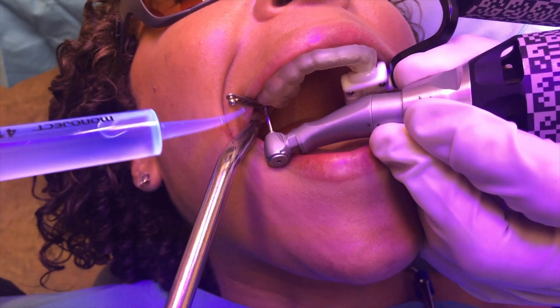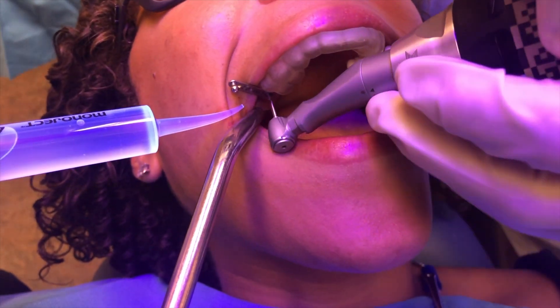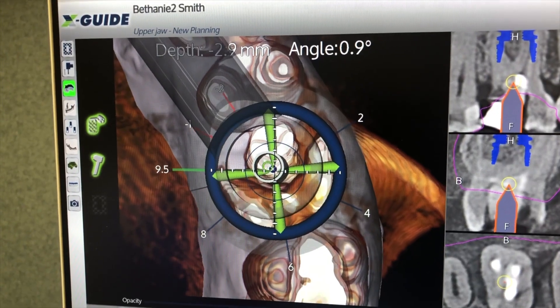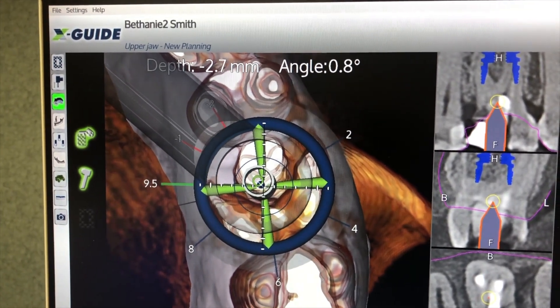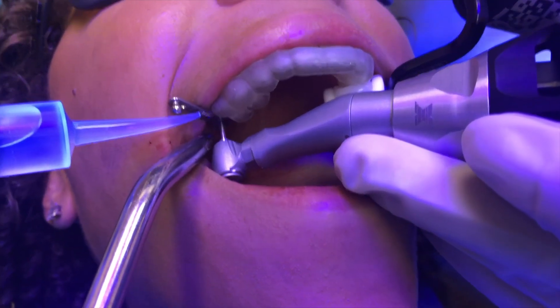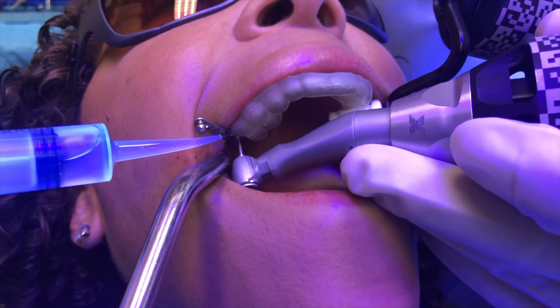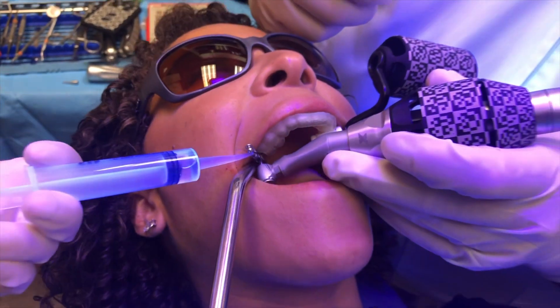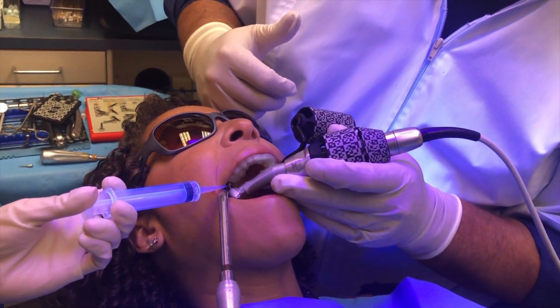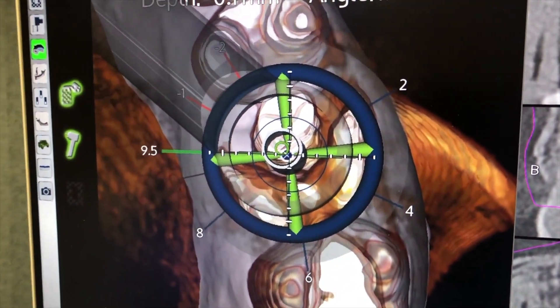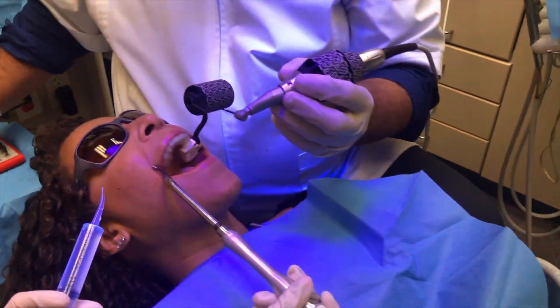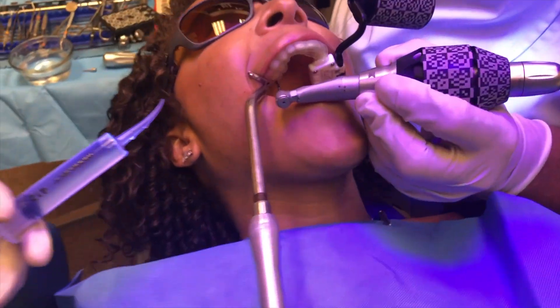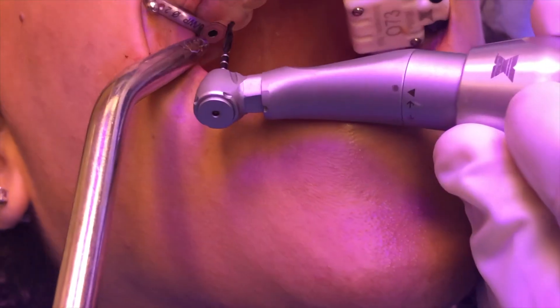Normally I take the precision drill — if I was using just the X-guide, I'd use that here. You can see I'm going through the template, and check that out — the accuracy here is unbelievable. We can see we're in a position right in the furcation of the roots. As we go in, the two systems are very, very much in the same position. I'm quite excited about this. I can see I am on target. It's a precision drill, so as we go to the two millimeter drill, this should confirm where we actually are.